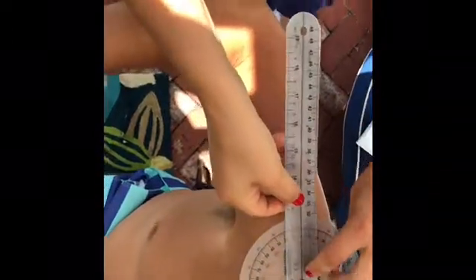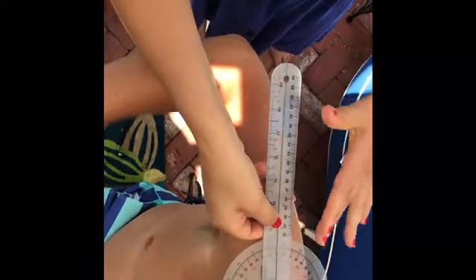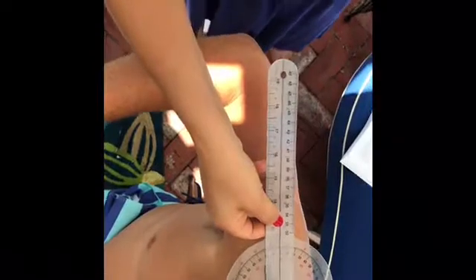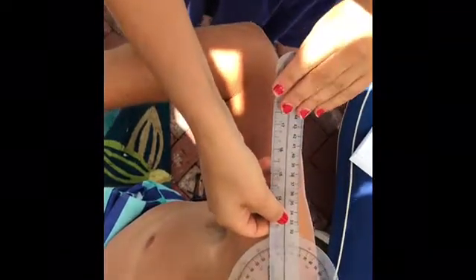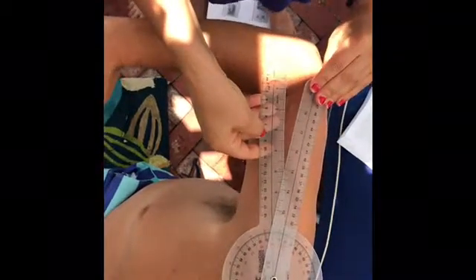We're going to be measuring shoulder horizontal abduction. The typical range of motion is 0 to 45 degrees, and the axis is on the superior aspect of the acromion process. The stable arm is parallel to the humerus prior to motion, and the moving arm is parallel to the humerus during motion. So go ahead and bring your shoulder back as far back as it can go. Is that as far back? All right. You are at 15 degrees.